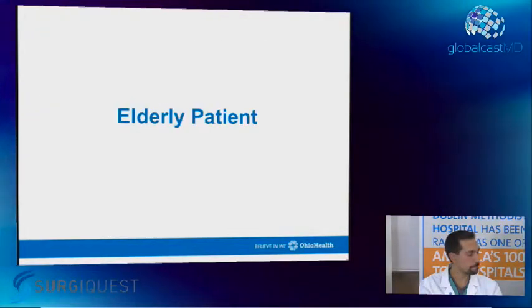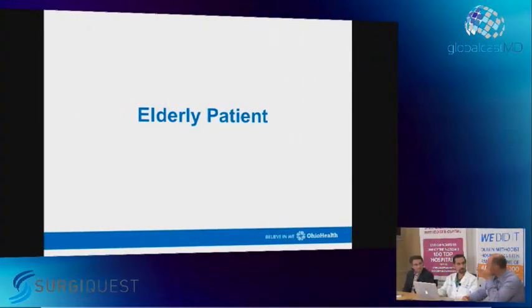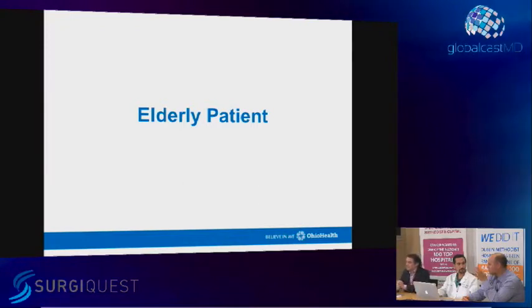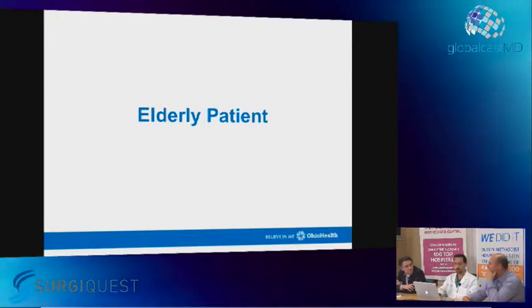I think when you measure these things, it makes a big difference. We've seen improvement in creatinines down the road with these bilateral tumors. I don't know why, but if you measure them at 6 months and a year later, we've seen some improvement. Yeah, in retrospect, though, maybe I would have waited a little bit longer than 2 months, just because of the size of the initial resection and the length of the ischemia time.